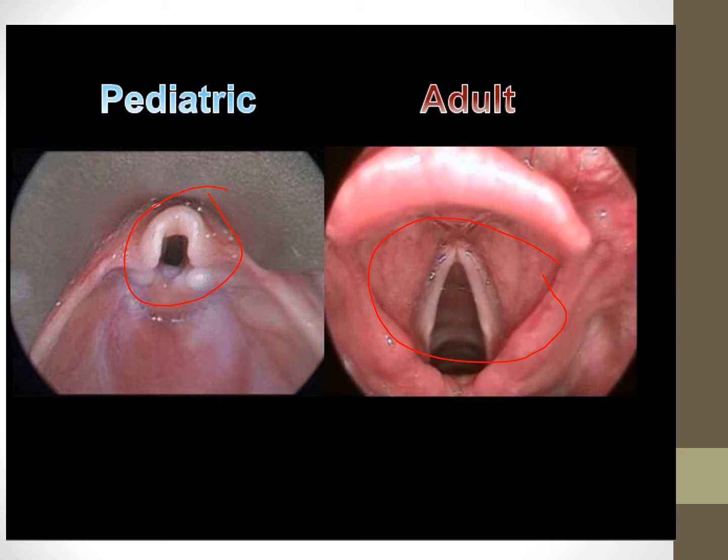So when we're looking at something like epiglottitis, croup, or LTB, we're looking at different things that could make it difficult to intubate. If a kid has LTB or croup, intubation is going to be difficult, right? And you're going to want someone very advanced. You might want video intubation equipment. This is where this all comes together. So I like this visualization just to show you the difference.